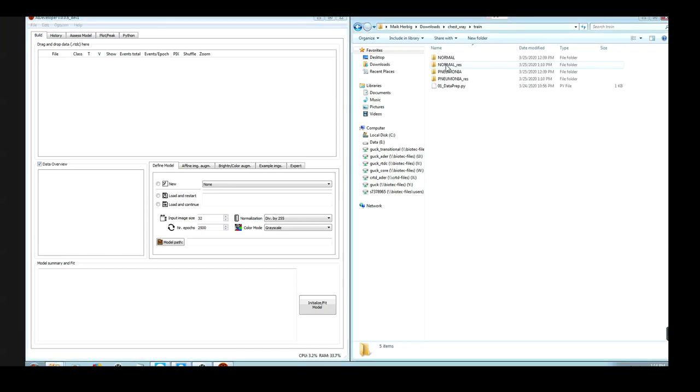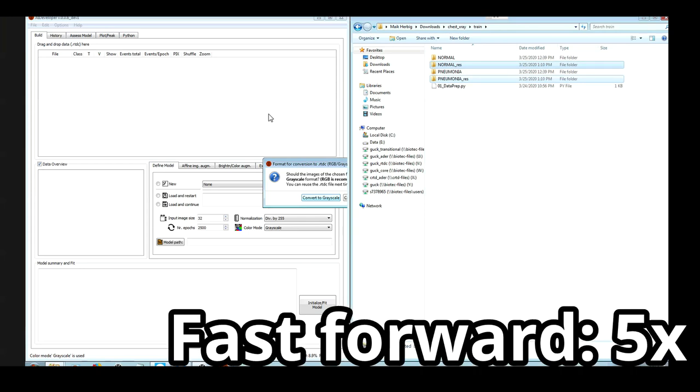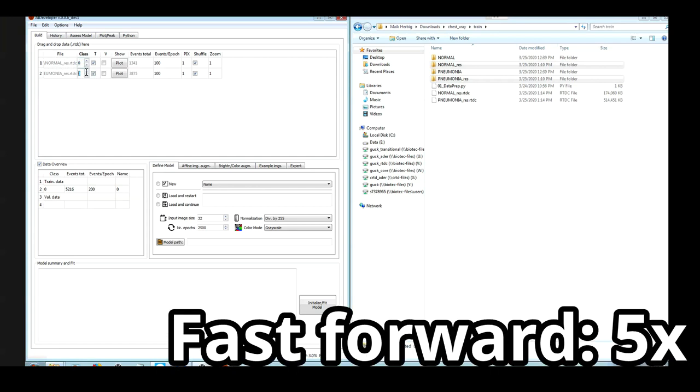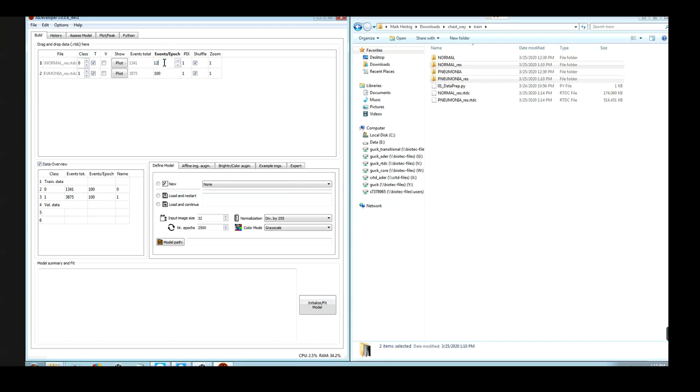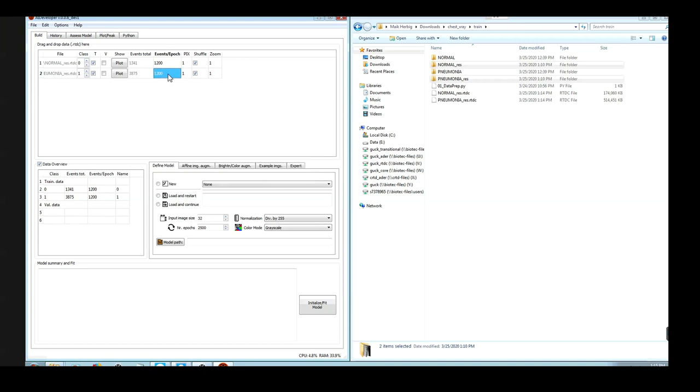Now let us insert the training data for normal and pneumonia, and select convert to grayscale as all these images are grayscale images. So this is training data. As you can see, there is a class imbalance. Therefore I would like to shuffle the dataset for each training iteration, and I just use 1200 images. So AI developer will sample random 1200 images from the available 3875 images in this case.